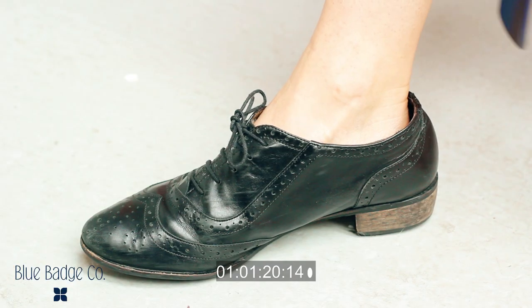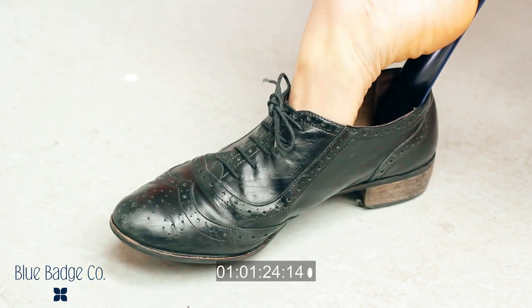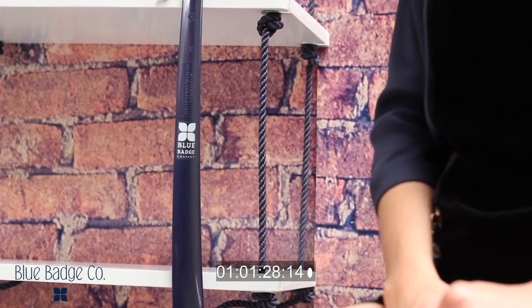For removing your shoes, all you have to do is take the shoe horn into the back of your heel and lift ever so slightly. Your foot should easily slide out of the shoe. Our shoe horns are an excellent product for helping you put on and remove shoes. They are also all made in the UK.